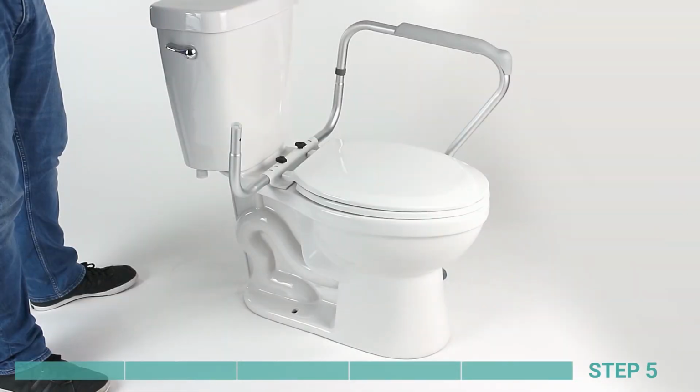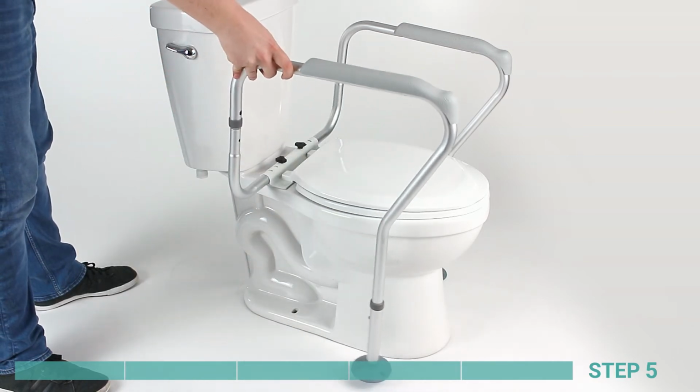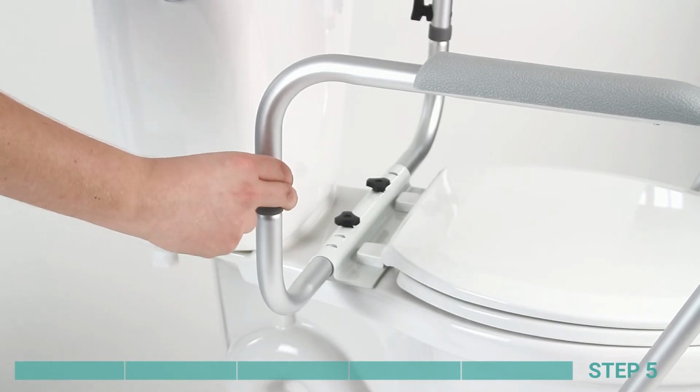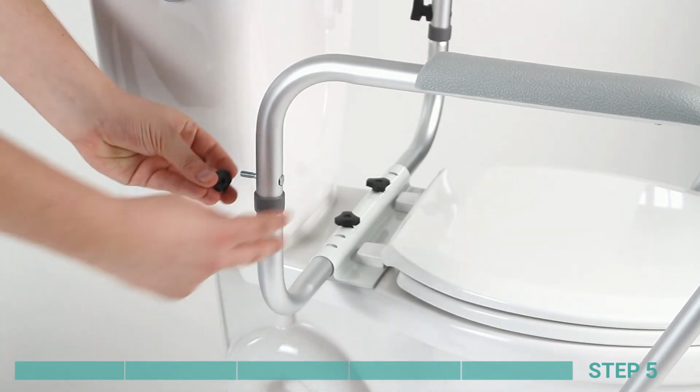Step 5. Fit top of armrest rail over narrow end of bracket arm. Align holes and thread plastic washer over bolt before inserting and tightening.